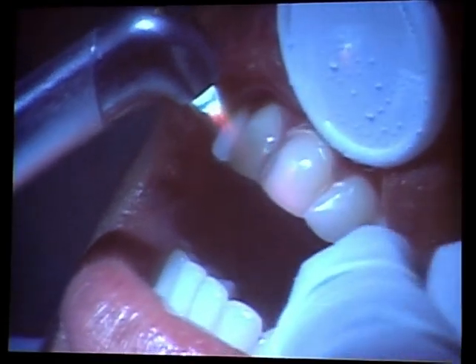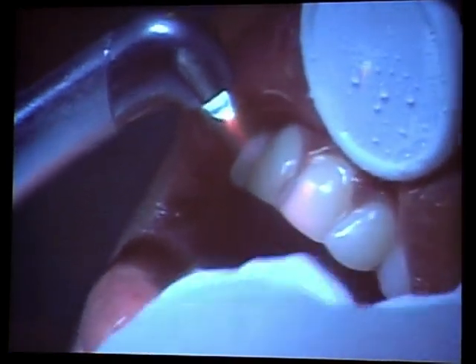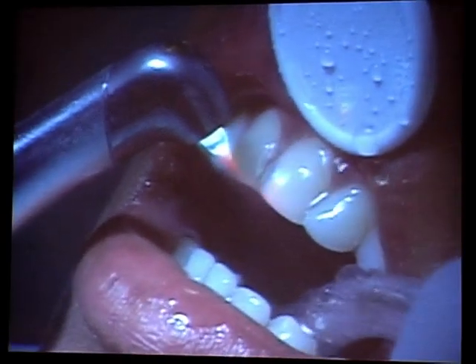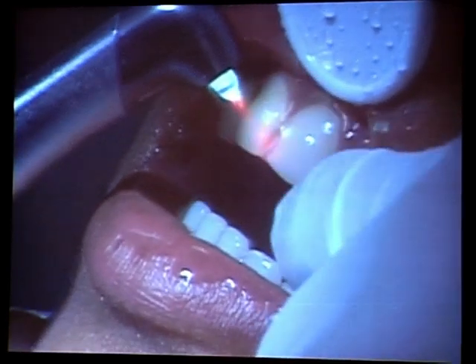And you can see if the distance is too large, nothing happens. But when I'm coming closer, you may see the white spots on the tooth.